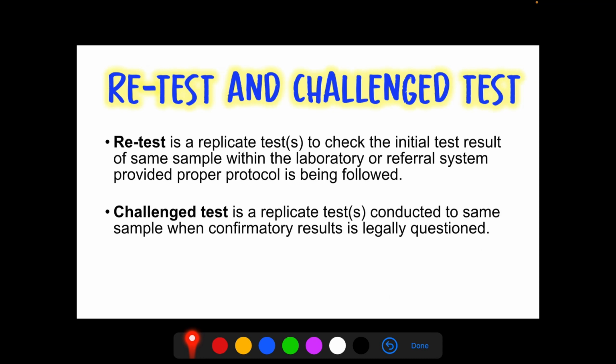And for the retest and challenge test, retest is a replicate test to check the initial test results of the same sample within the laboratory or referral system, provided proper protocol is being followed. The challenge test is a replicate test conducted on the same sample when confirmatory results are legally questioned. So that's the difference between retest and challenge test.